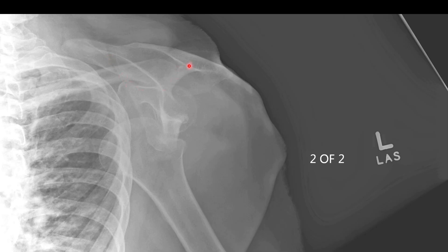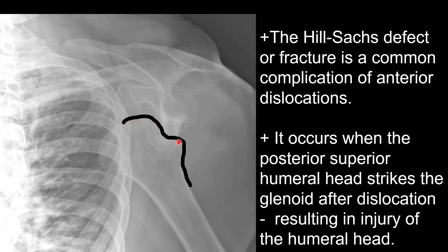Now we have a radiograph of the transcapular Y view. We can see the body wall of the patient here, which is going to be anterior, and this will be posterior. We can see the glenoid and the humeral head. If we follow the contour of the humeral head, we can see this impaction fracture here. This impaction fracture is known as the Hill-Sachs fracture or Hill-Sachs defect. It occurs due to anterior dislocation of the shoulder with subsequent striking of the superior posterior humeral head against the glenoid, and is an important thing to look for in all patients with dislocation.